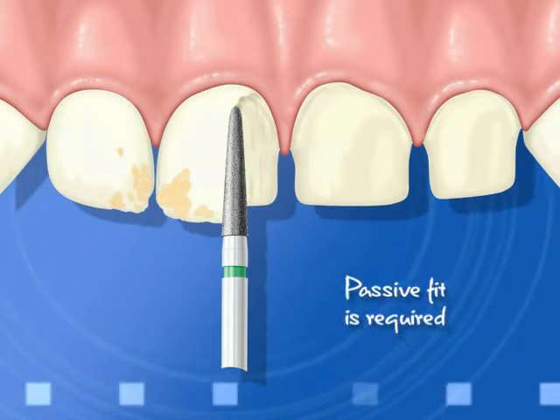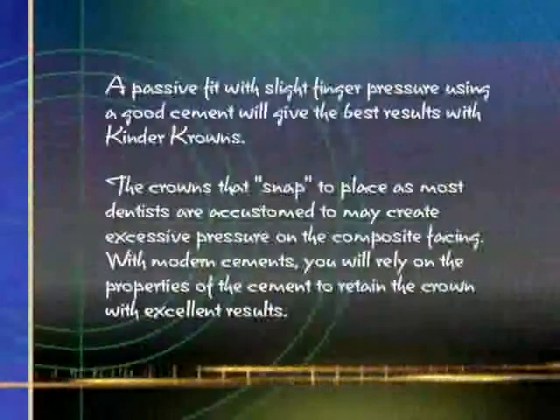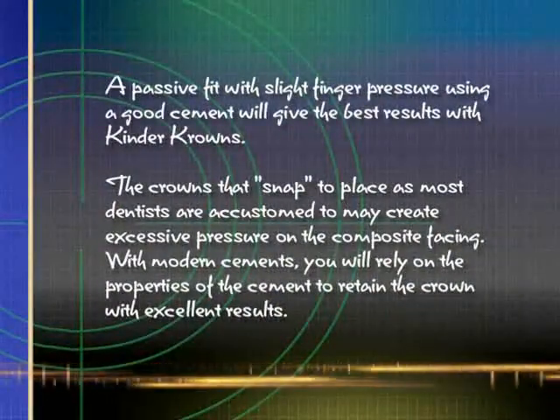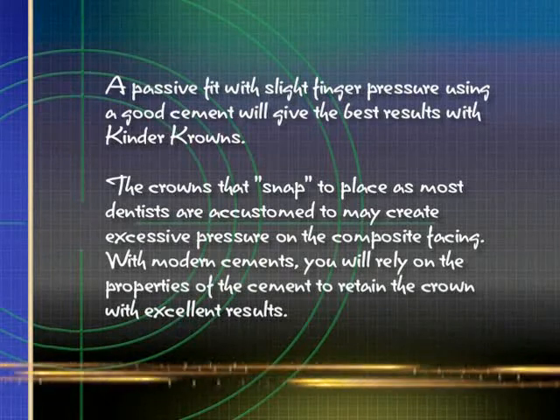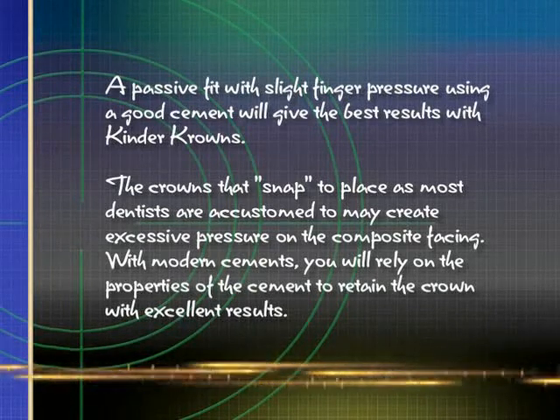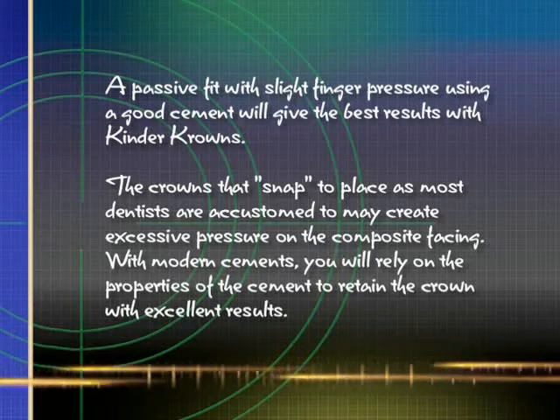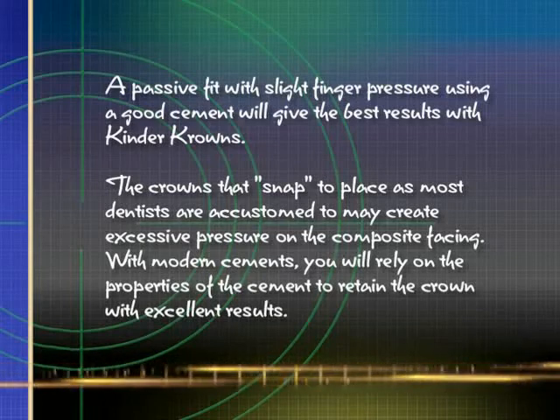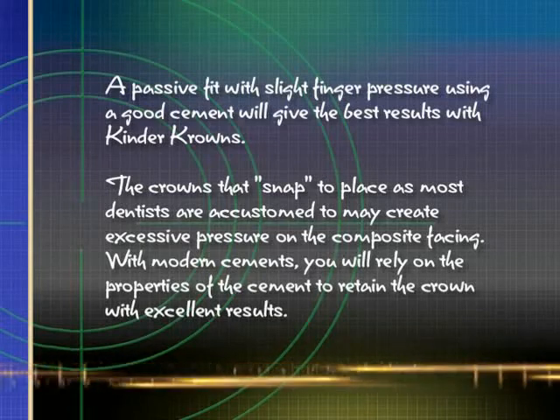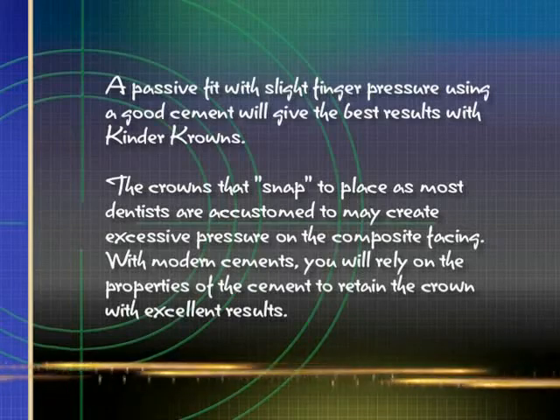The most important key to remember is that a passive fit is required. Important: a passive fit with slight finger pressure using a good cement will give the best results with Kinder crowns. The crowns that snap to place, as most dentists are accustomed to, may create excessive pressure on the composite facing. With modern cements, you will rely on the properties of the cement to retain the crown with excellent results.